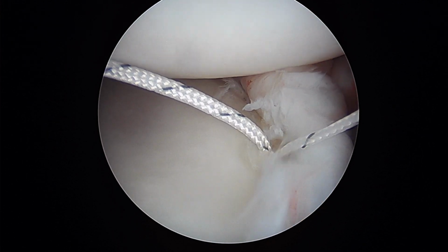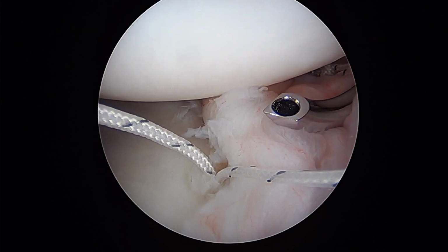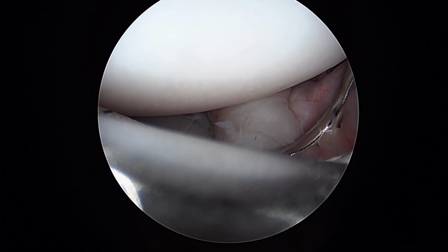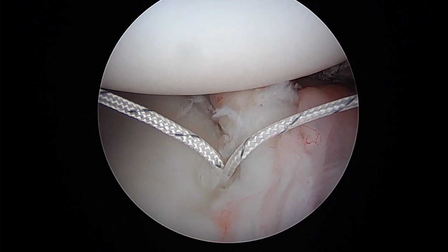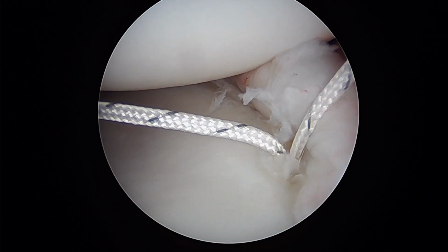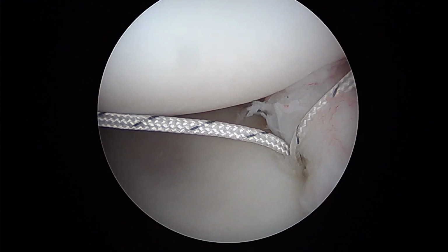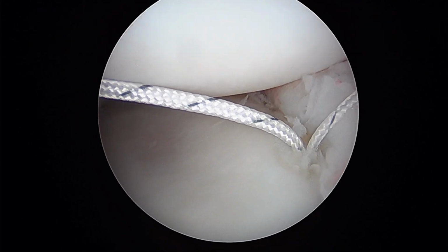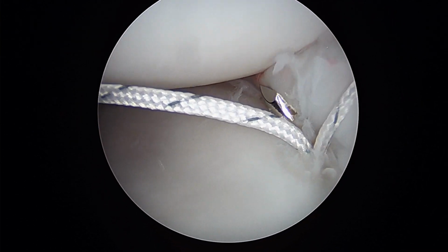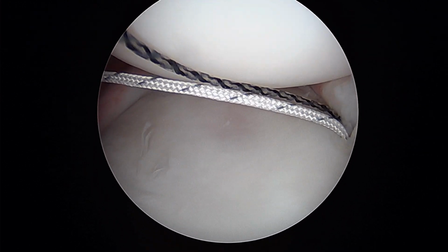Left. Yeah. And we're going to rehearse the stitch by starting here. Pull that back. And we're going to rotate. We're going to go in right about here. There you can see it's coming through. Show you some more in a little bit.